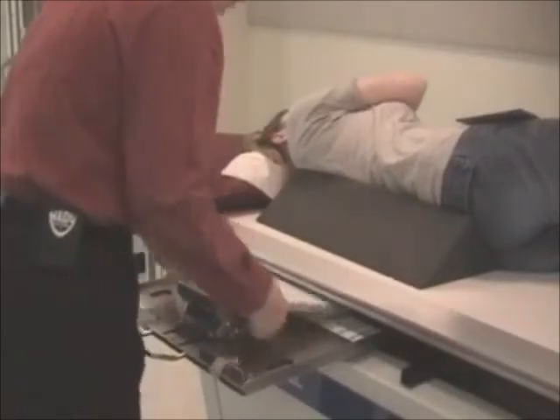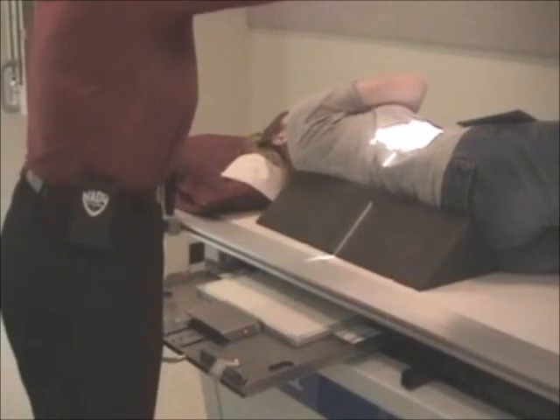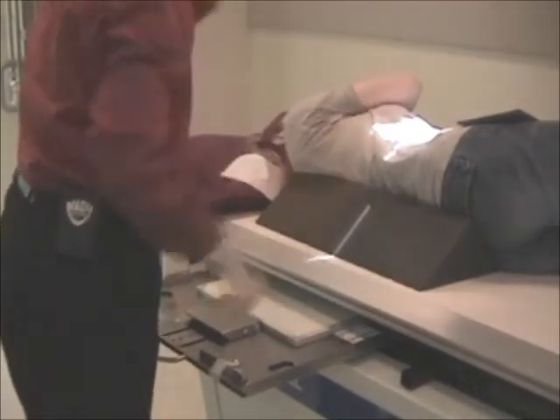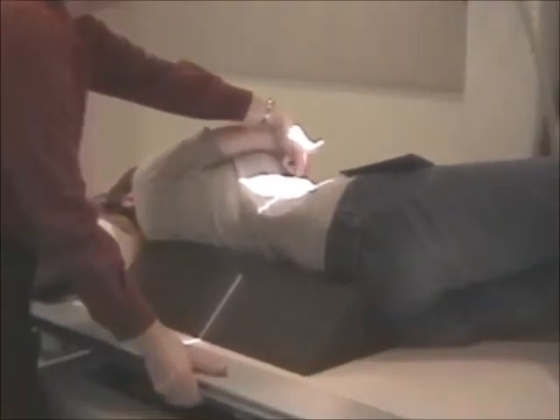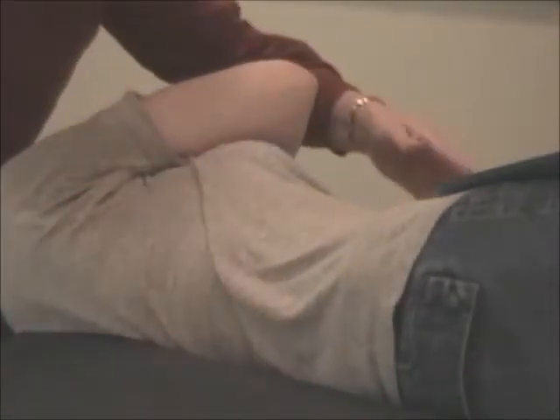Yeah. Cassette will go lengthwise. ID to the top. Fix your field size. And the xiphoid again. Find the xiphoid. And I'm going to be 2 inches below the xiphoid and approximately 2 inches to the right of the xiphoid. I'm going to look at the patient and I'm going to see that it's centered. Her body is centered to the frame.